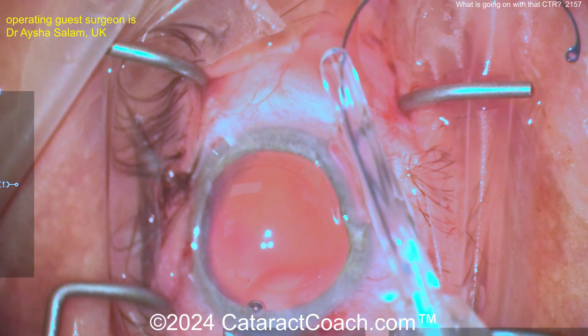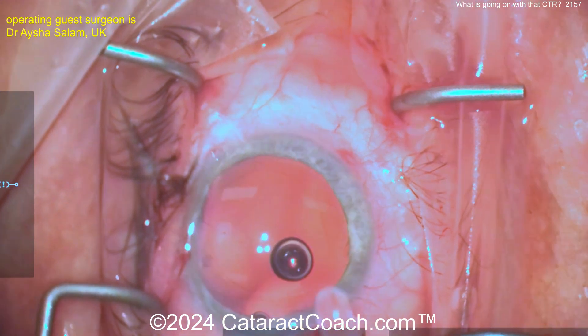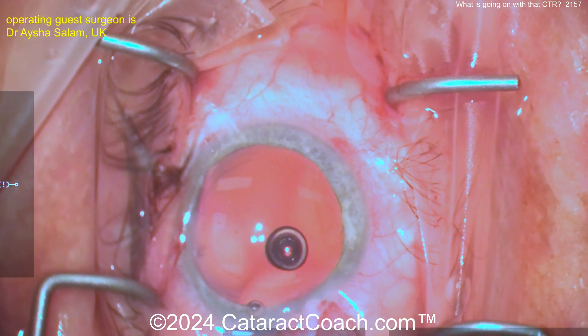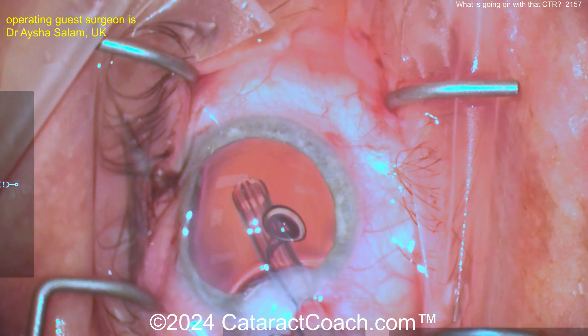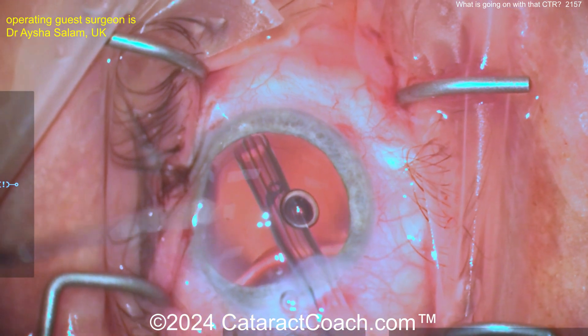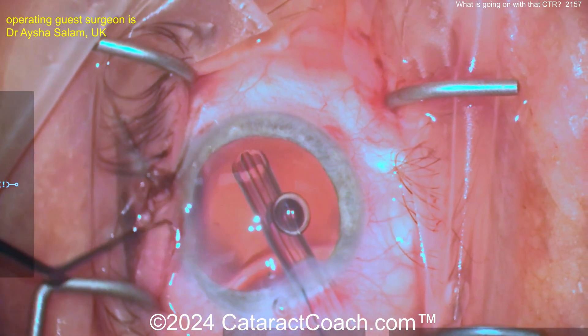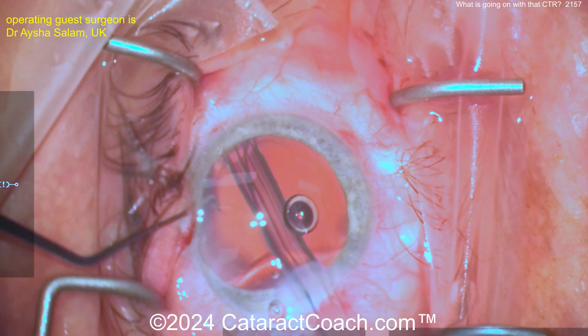What you want to do is really angle it as you inject it towards a more tangential approach — don't go straight ahead. You want to go to the extreme left or extreme right of the incision. I go to the extreme left because of the way it's curved. Going straight ahead makes it far more challenging. Tilt the injector all the way towards the paracentesis.